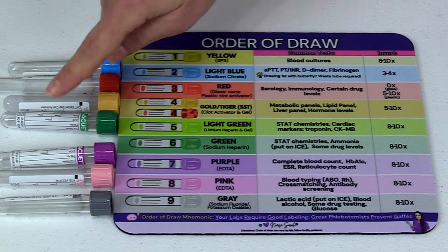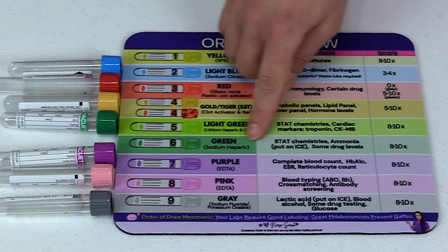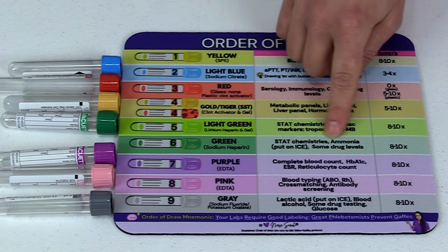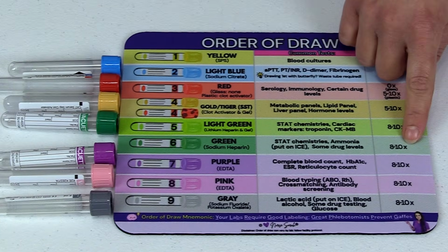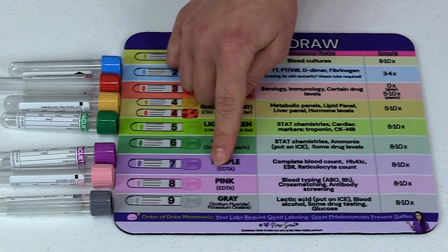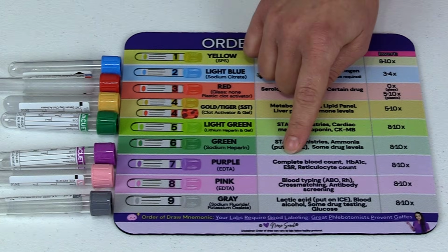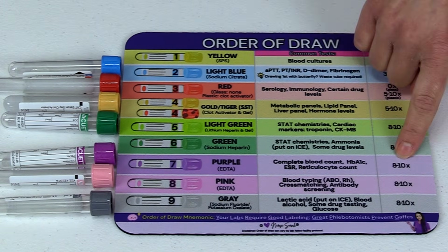Then the dark green, or the green color, has a sodium heparin. It's going to be your stat chemistries, your ammonia, again put that on ice, and some drug levels. Has an inversion time of 8 to 10. Purple, also known as lavender, has EDTA in it. That's going to be your CBCs, your hemoglobin A1Cs, and so forth. Inversion time is about 8 to 10 times.